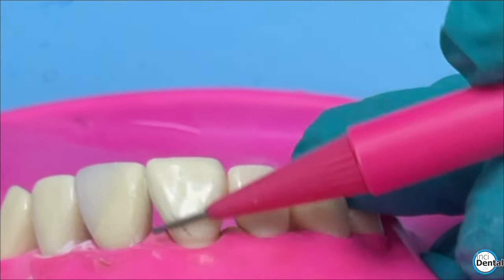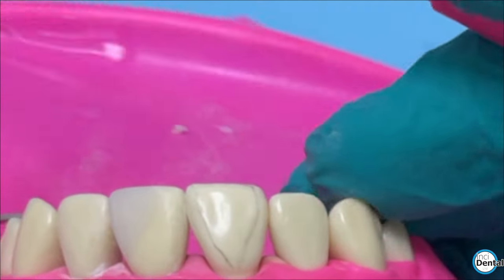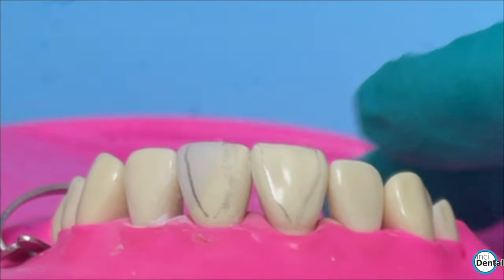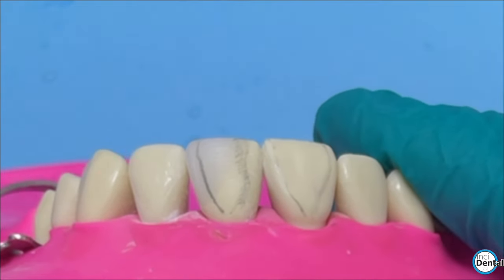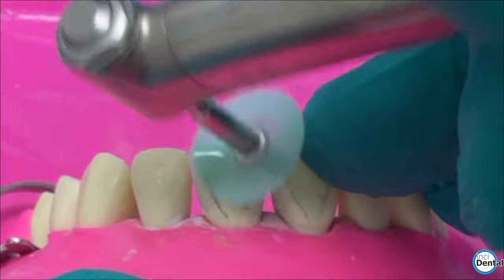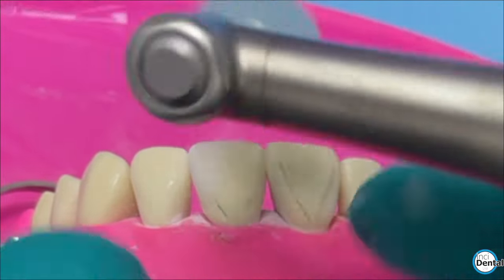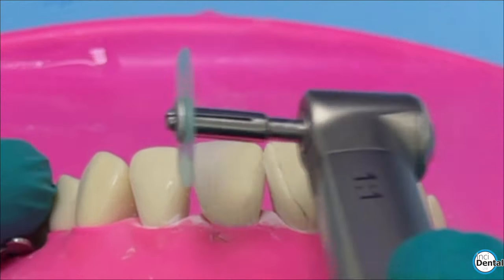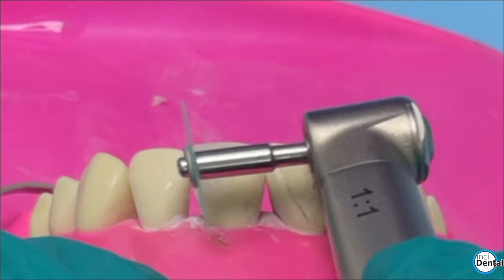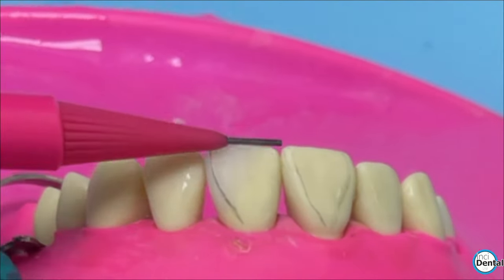Now it's time to check the line angles. We're using a propelling pencil — use the side of it to mark the line angles on the adjacent tooth, then bring that pencil across and mark them on the restoration with the side of the pencil, not the tip. That gives you an idea of where your line angles are. For this demo it's not looking too bad, but the distal line angle could do with pushing out a little bit. Using the green contouring disc, I'm polishing flat mesially to that line angle, which effectively pushes it out towards the edge of the tooth. You can also wrap in from the distal side to nudge it in the other way.